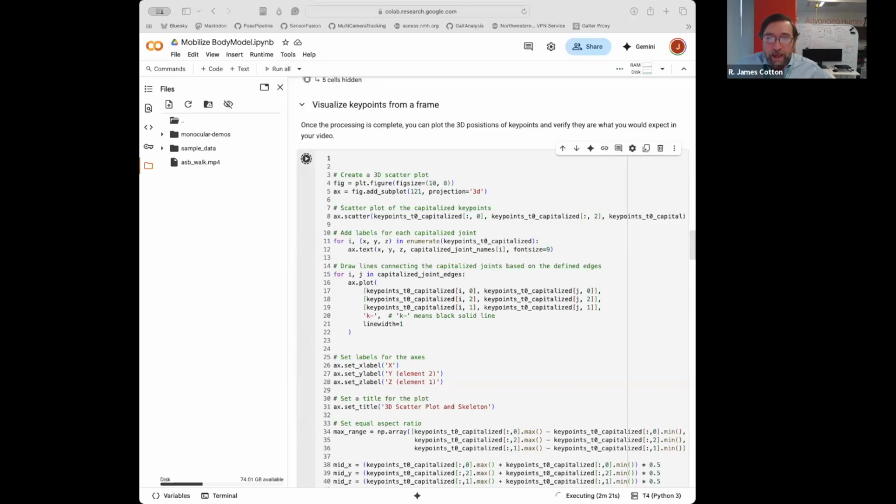All right. What are the accuracies for the static balance tests? So we do postural sway, but I don't think we broke down the accuracy for that specifically. But for the timed up and go, that's actually one of the ones we do a little bit worse on, partly because of the pelvis tracking when they're in the chair. So we're still around 3 or 4 degrees for that.